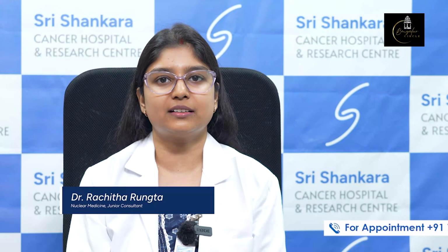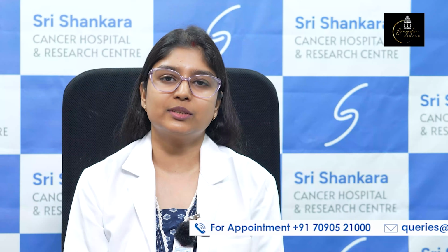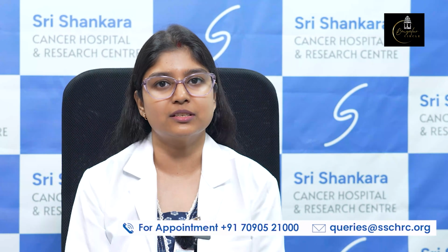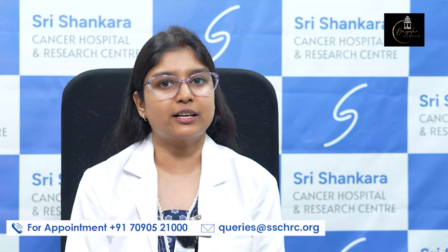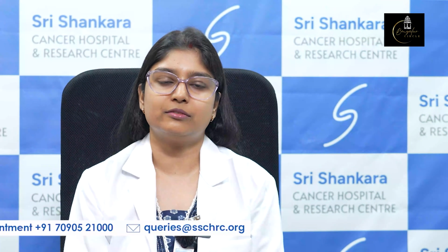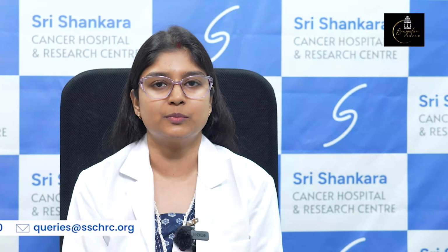Today we will understand the basics of nuclear medicine, the facilities we have in nuclear medicine and a few important points. So in nuclear medicine we use radiation which is in a very minimal dose. A very minimal dose of radiation is injected into the patient. The radioactive medicine we use is called a radiotracer. So once the injection is done, we can use it for nuclear medicine diagnostic as well as therapeutic procedures.